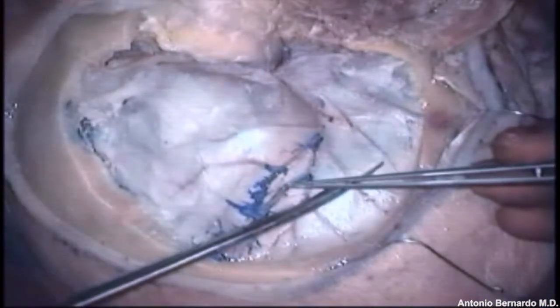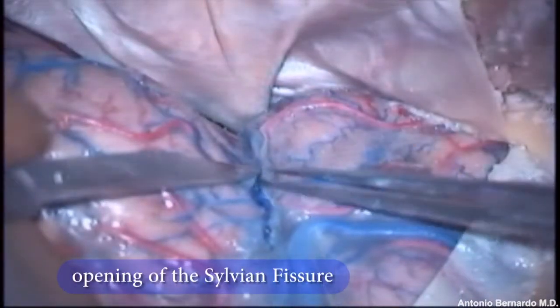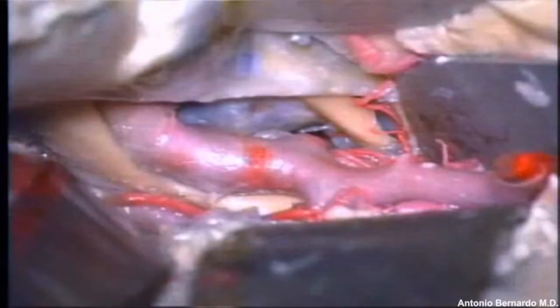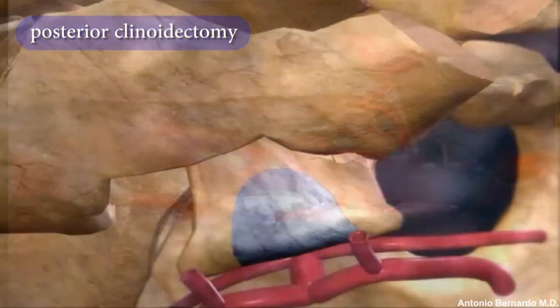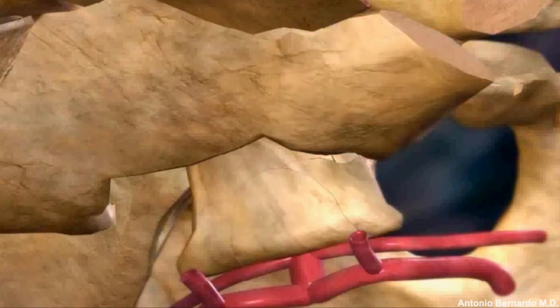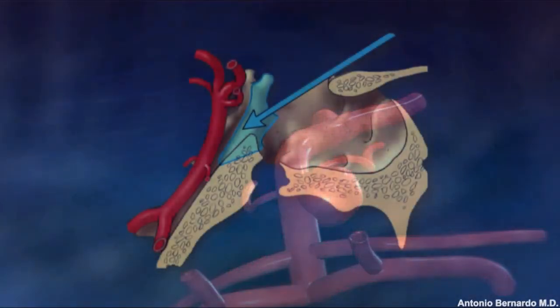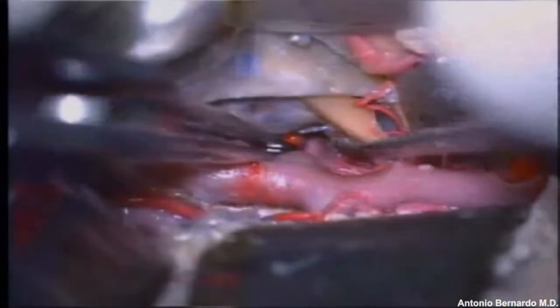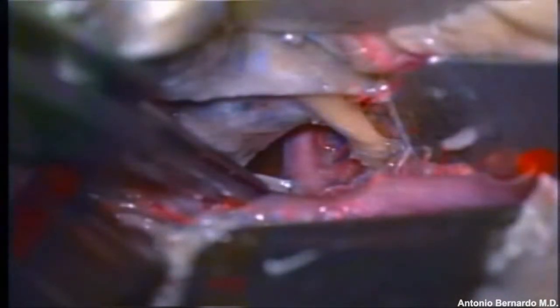The dura is opened in a circular fashion, the Sylvian fissure is split, and the region of the posterior clinoid process is exposed. The dorsum sellae obscures good visualization of the interpeduncular fossa and the entire region posterior to the dorsum sellae. In order to achieve good visualization of the basilar artery and the entire region behind the dorsum sellae, the posterior clinoid process needs to be removed.